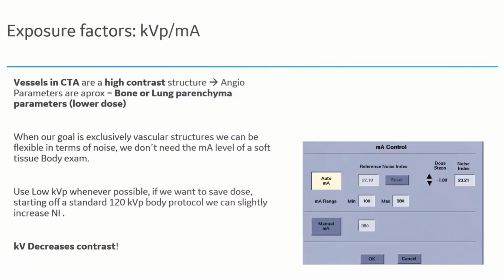Any question about it? No, not really, just for reference. Notice that the reference noise index for this case is 22.10, due to the anatomical region and probably due to slice thickness. So here we used a dose step, and we chose -1 dose step.